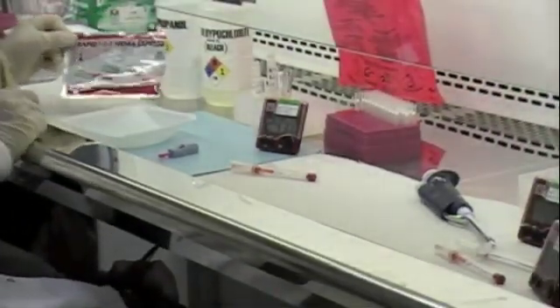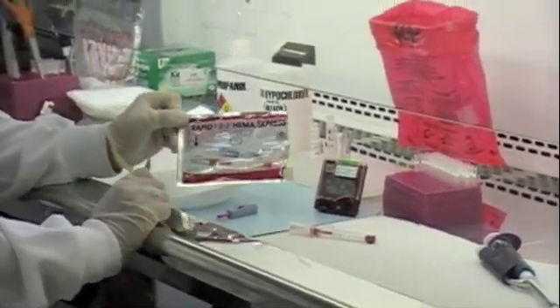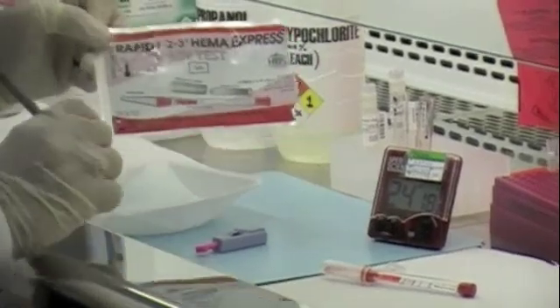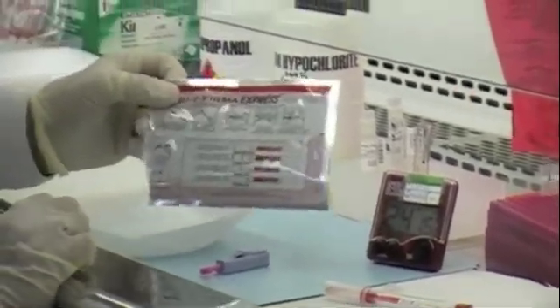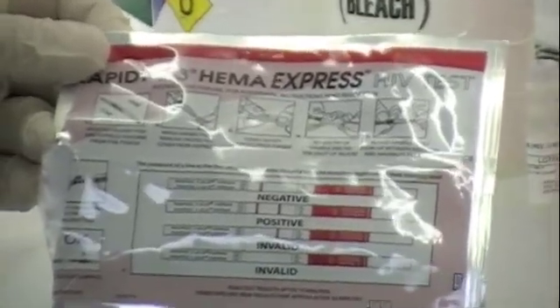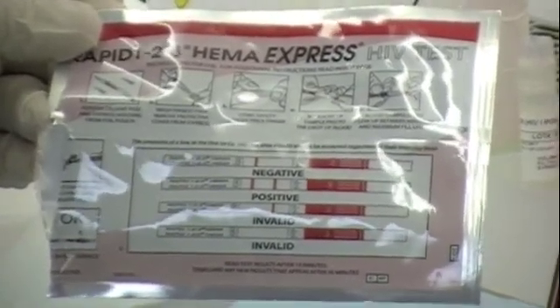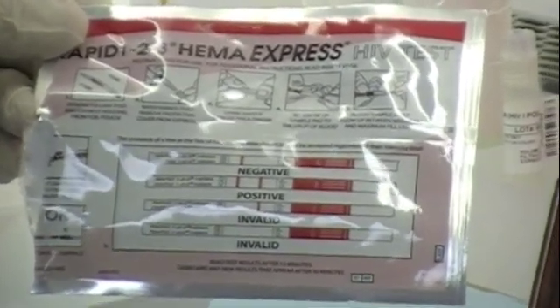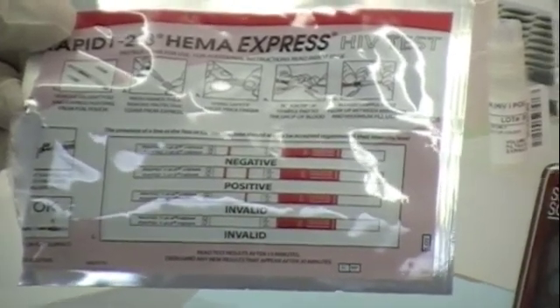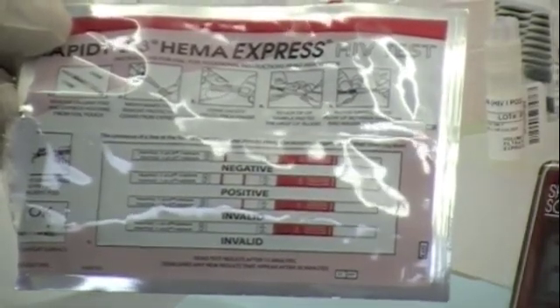The express HIV test pouch provides a full description on the back of the test explaining how it is administered and how the results are interpreted. Please always refer to the back of the pouch for a quick explanation of how to do the test. Each test is also accompanied with an insert page that explains how the test is performed, how the results are interpreted, and additional useful information.